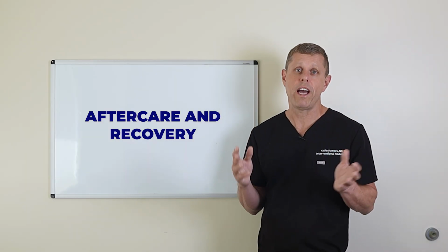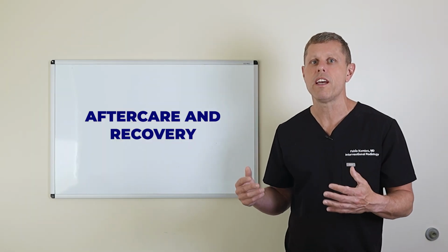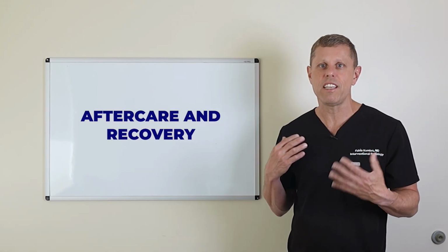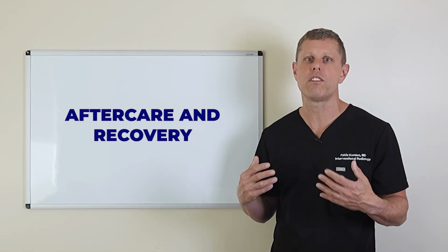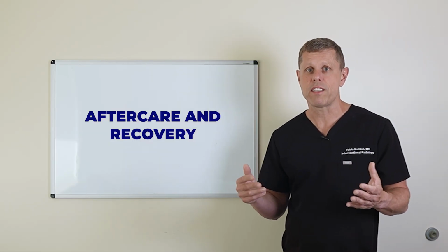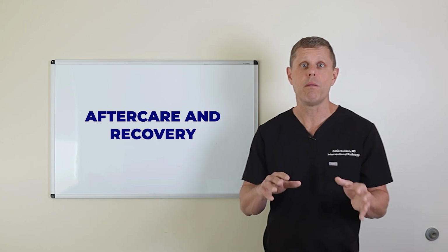Patients who have them for dialysis, for example, have them for a long time. I have discussed this with a lot of different physicians, and most physicians would agree that the most important thing is to keep the site very clean. And we think that even cleaning the site with soap and water, on a daily basis, or every once in a while, is a good thing to keep the site clean as long as you use a clean dressing afterwards. There are sterile pads that you can apply over the dressing, and I think the important thing is to change the dressing frequently. I don't want that dressing to stay there for several weeks, so it accumulates moisture and discharge in the site, and that can be more prone to infection.